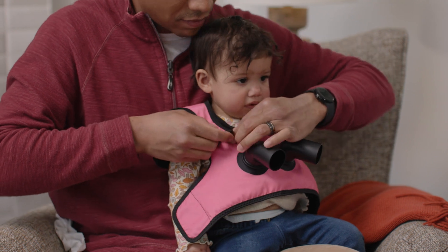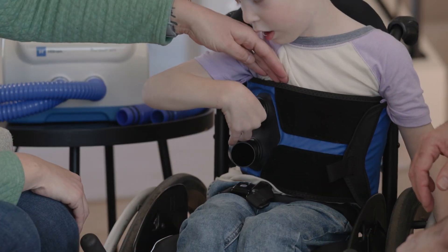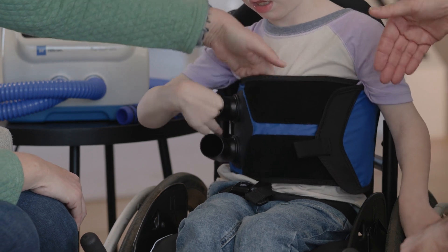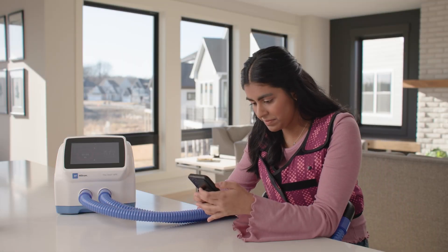Before you begin using your device, you'll need to ensure your garment fits correctly. The Vest APX system garment was designed to fit your body. Depending on your chest circumference, your physician, a Baxter trainer, respiratory therapist, or caregiver will select a suitable garment style and size. To measure for the correct size garment, if possible, start by standing for the measurement.